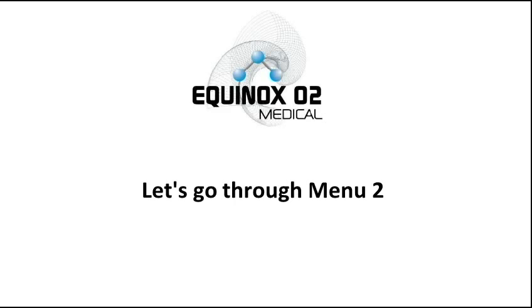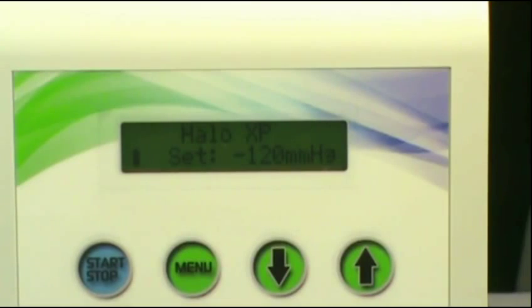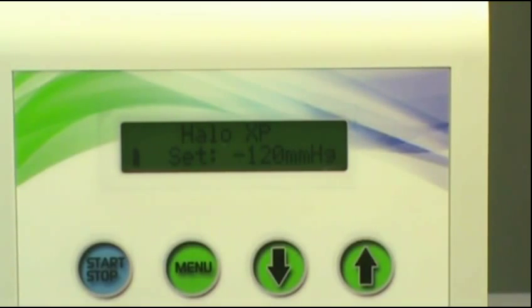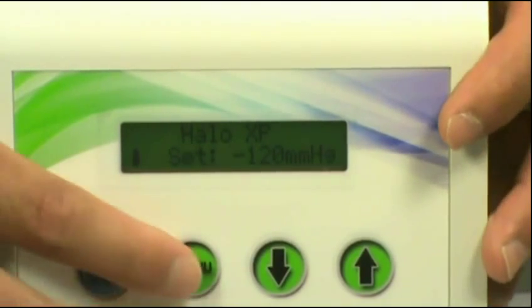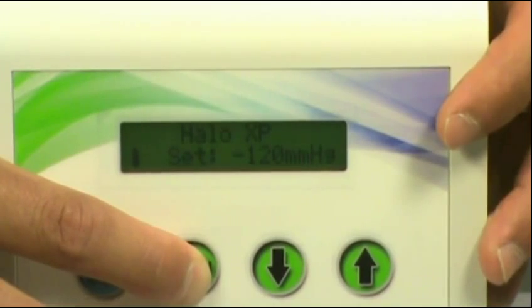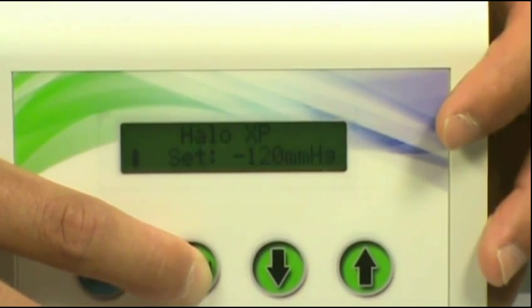Press the menu button for ten seconds. And this will allow us to access the second menu. You will hear the first beep, which indicates your first menu. Continue to hold. It will take you to the second menu.